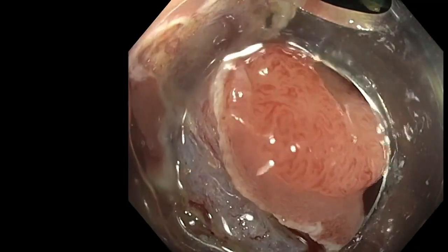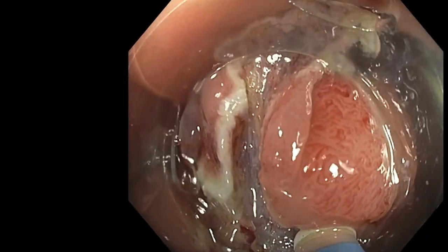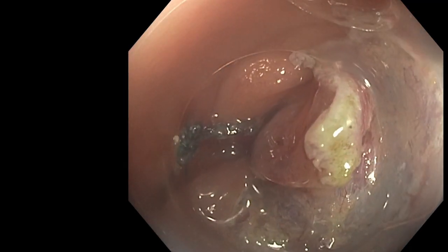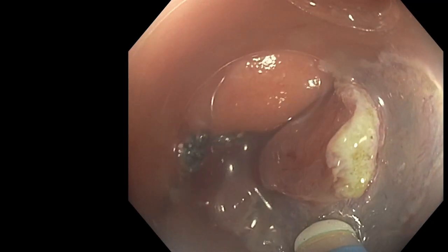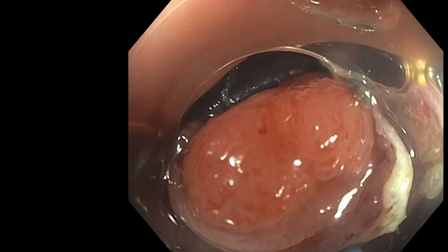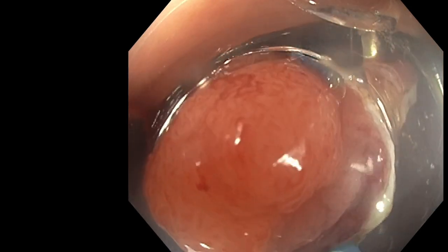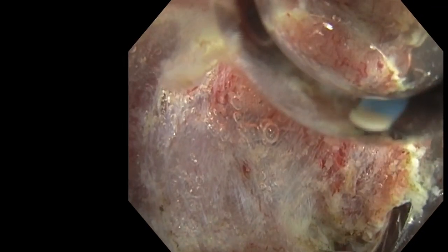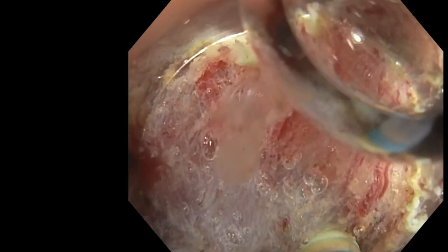So here you can see there is a small vessel. We have some areas which are blind, you're right, but thanks to good movement, trying to go outside, to pull back and to avoid pushing, we will finally see the layer.